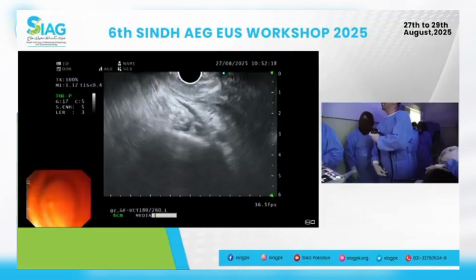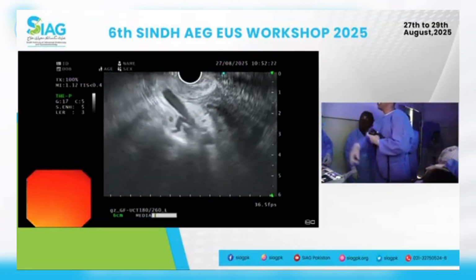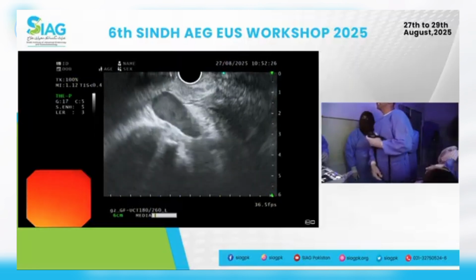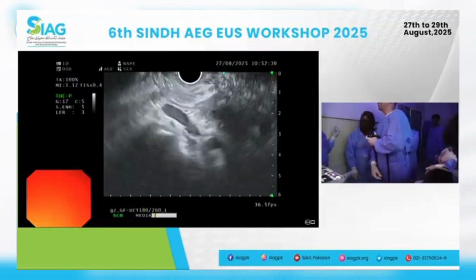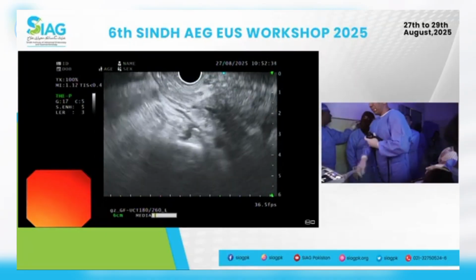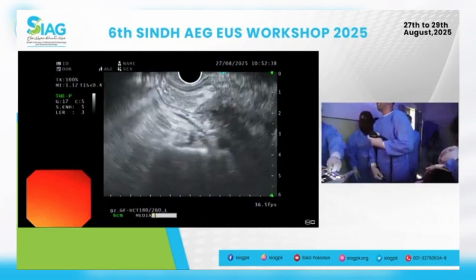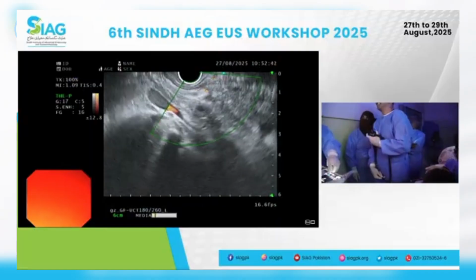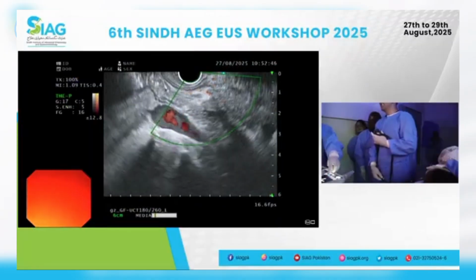So you start to see the pancreatic parenchyma at that stage there. And I'm compressing the IVC as you see it there, because I'm trying to overcompensate. We didn't want to fall back in again. Doppler दीजिएगा please. So you start seeing the stent there. It's the distal end of the CBD. So I know I'm in the right ballpark.